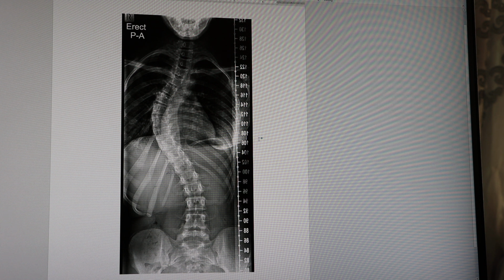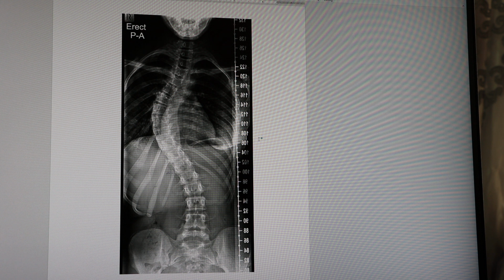as you all know, the investigation for a scoliotic patient, or when you have a scoliotic patient in your clinic, even before you know that he is definitely having scoliosis, you'll have to go through the screening and then looking for signs, history taking, and finally when you are suspicious that this patient might actually be having a scoliotic curve, then you go for the X-ray imaging.